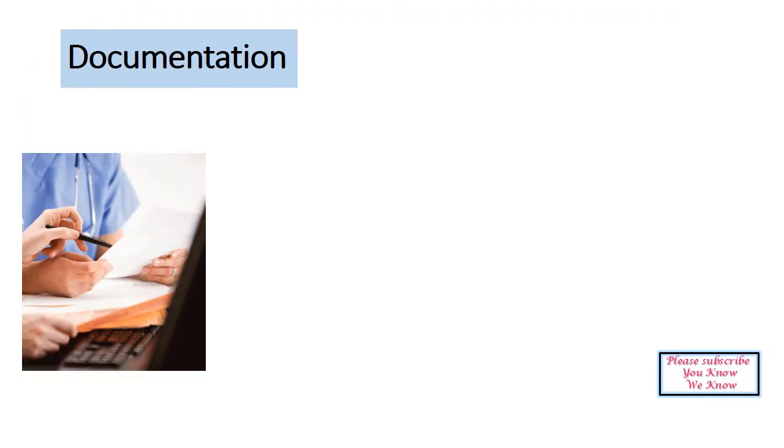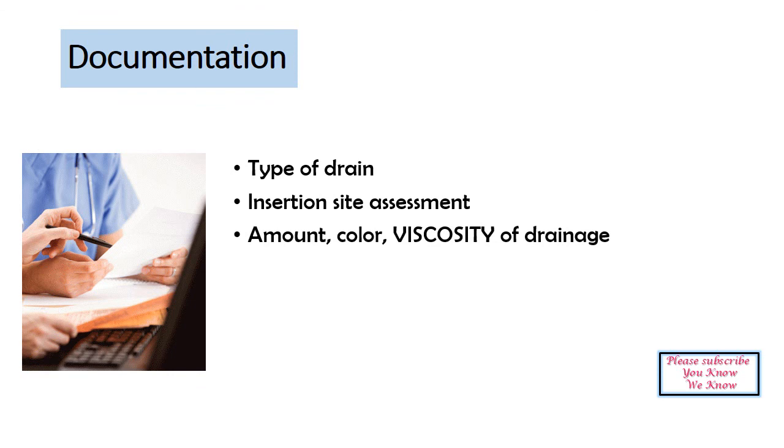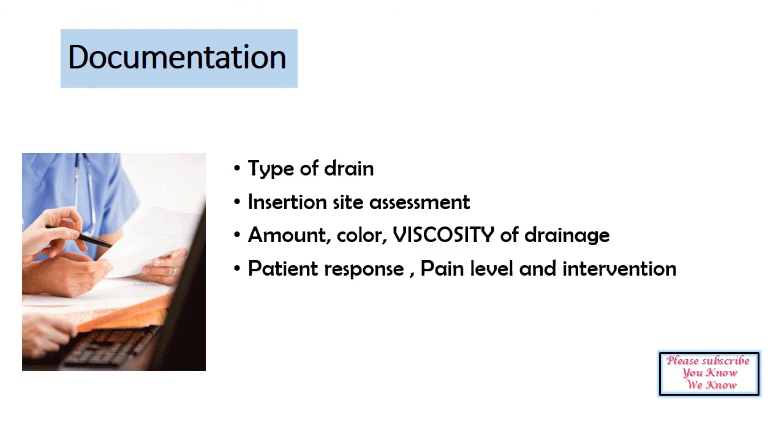Nurse's responsibility in documentation: the type of drain, insertion site and assessment, and the amount, color and viscosity of the drainage are to be documented. Patient response, pain level and interventions are to be assessed using a pain assessment tool. Charting on the intake and output chart, the total output is to be documented.